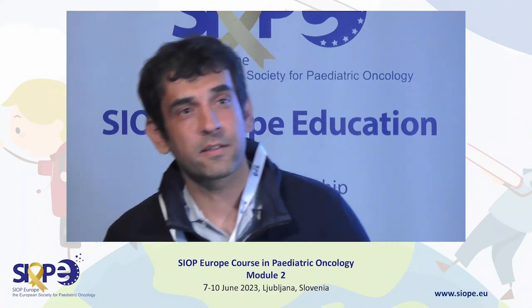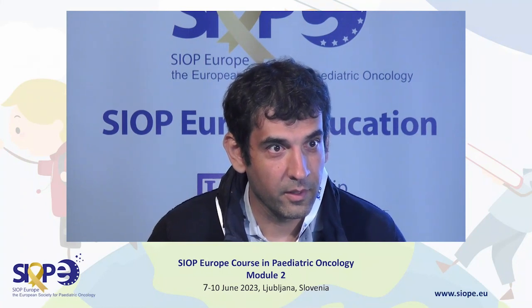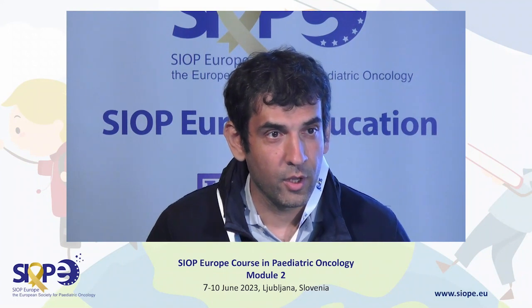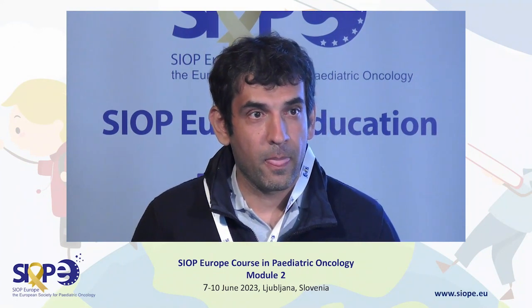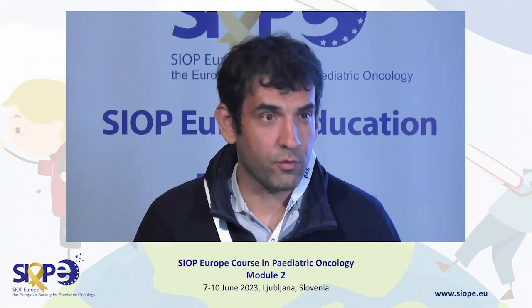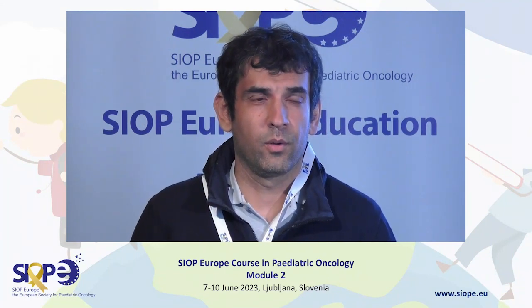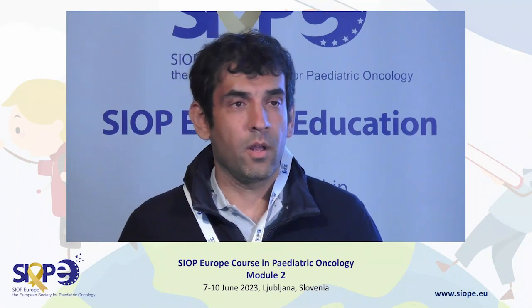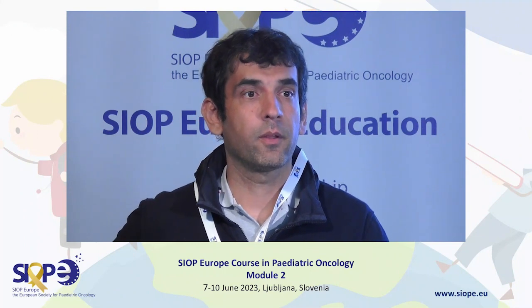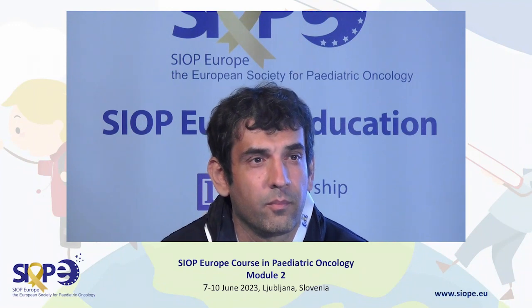I think one more and last question then. Sorry, I'm very interested about where you have your microscope. It depends as well on where you perform the lumbar puncture and the bone marrow aspiration, because this is very different from center to center. For us, we do everything under anesthesia, which is not always the best solution, I guess. But where do you do that? If you are in the anesthesia room, do you have your lumbar puncture ready and your microscope next to you? Do you wait for the sample to be sent to the morphological analysis?